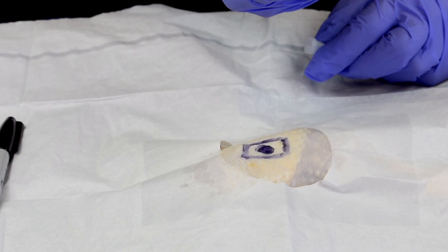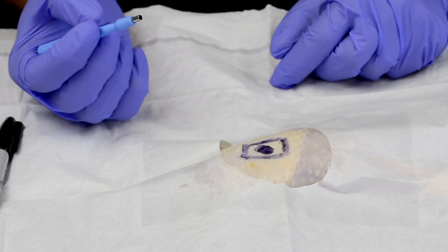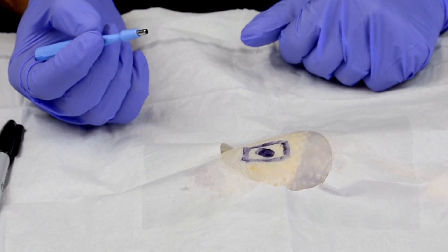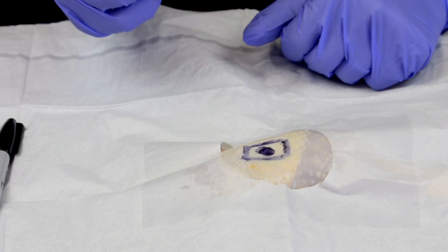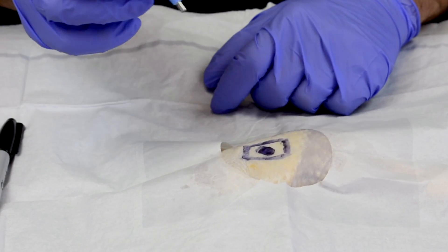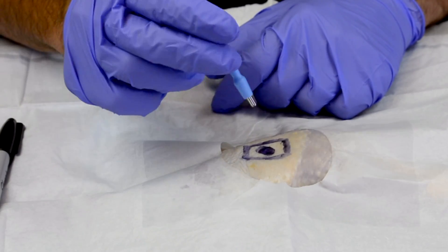The reason we use a punch biopsy is that it can get all the way down to the subcutaneous fat. If the cancerous lesion is a melanoma, we would know the actual depth of the tumor, so we would know exactly how to perform the next phase of treatment for the patient surgically.